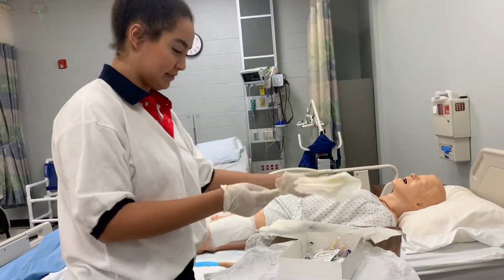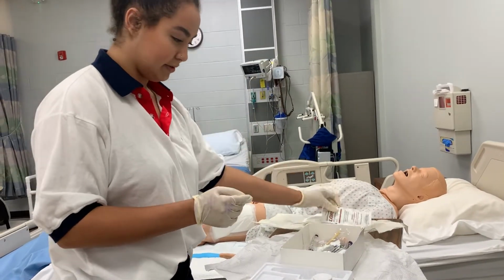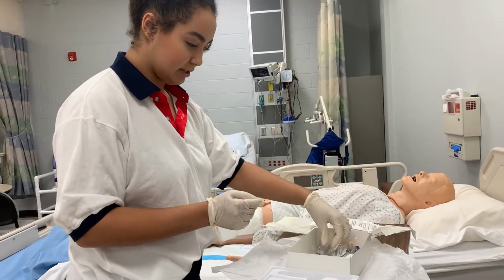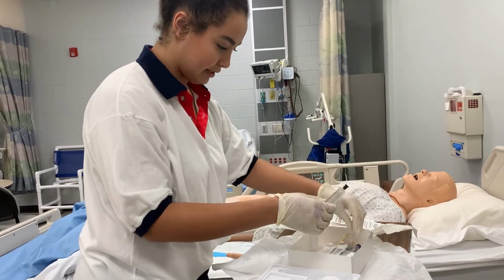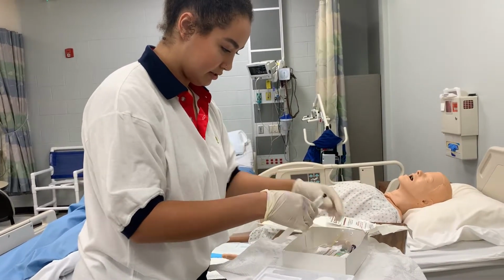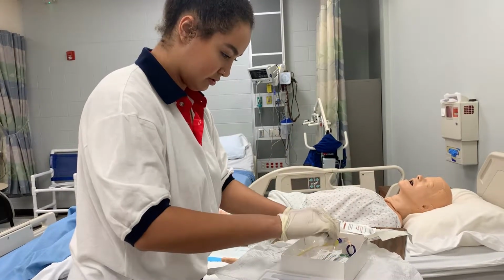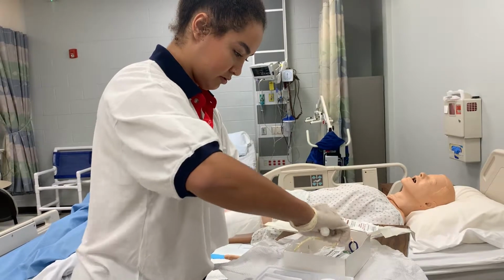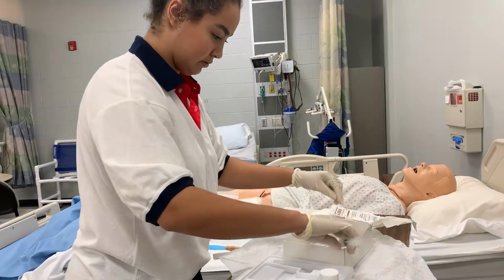I would place it around his genitalia. And then iodine wipes, which we will not be using. I have my lubricant, I have my swabs, and I have my saline, which I am going to connect here.